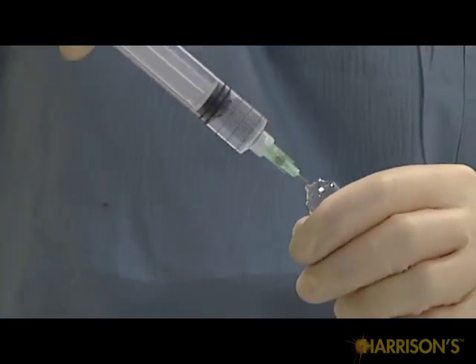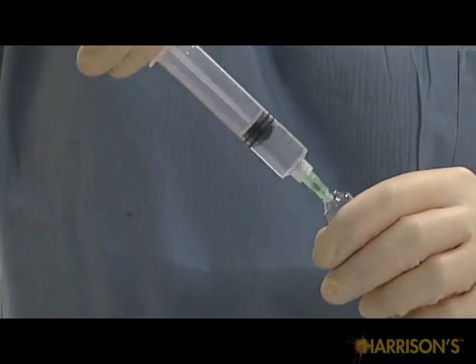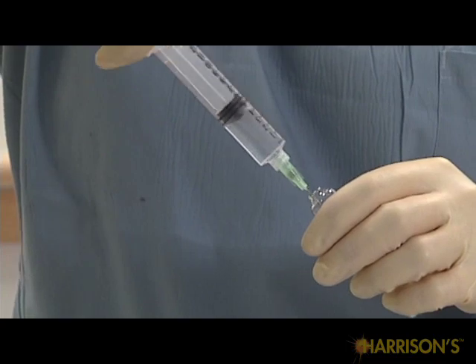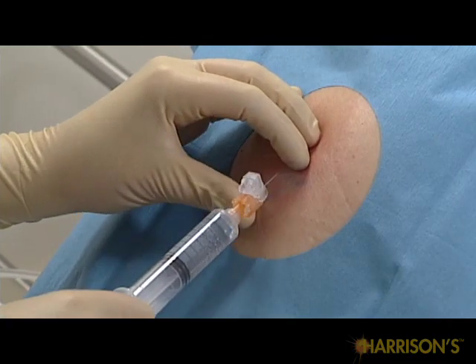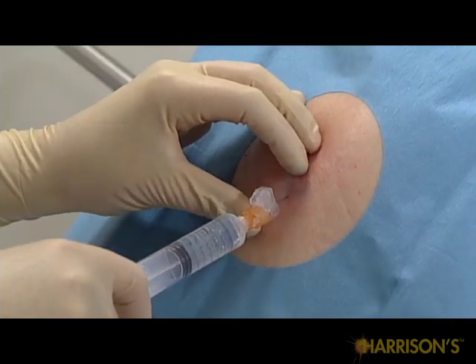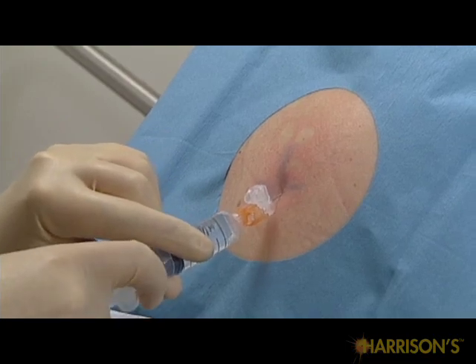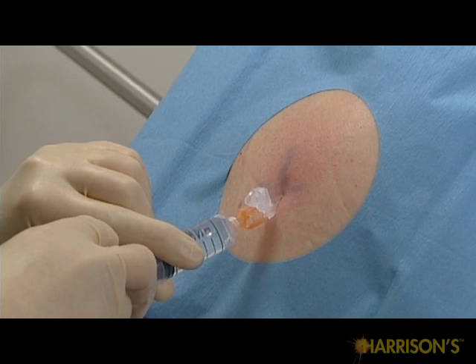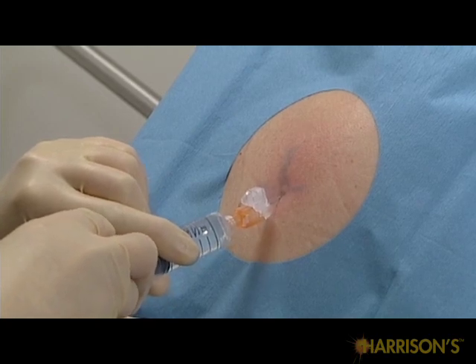Draw 3 to 8 cc's of 1% lidocaine into the 10 cc syringe. Use 1 to 1.5 cc's to numb the epidermis and dermis with a skin wheal using the 27 or 25 gauge needle.